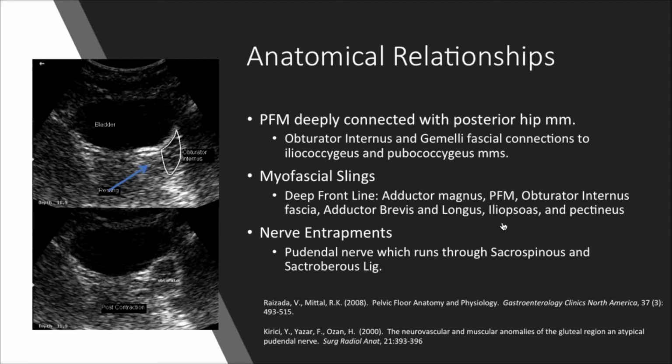The fascia of the pelvic floor, the actual pelvic floor, is in communication with a lot of these structures. So again, it's very important to make sure that you're cognizant of that connection when you're doing your general sports orthopedic assessments, and not to forget that even though you don't necessarily have a pelvic floor background, this is something that could be contributing to their dysfunction.